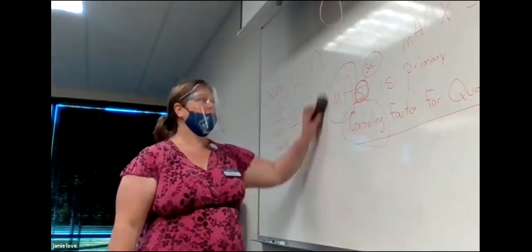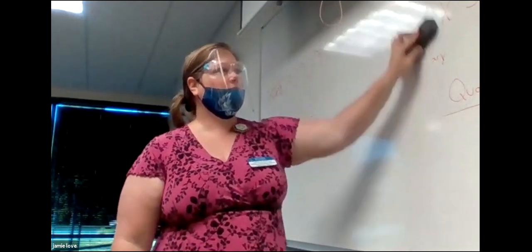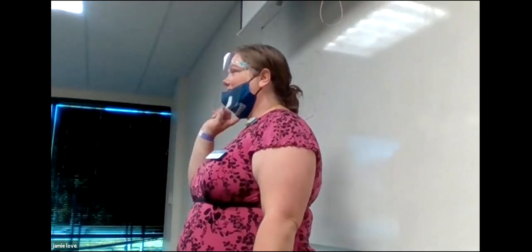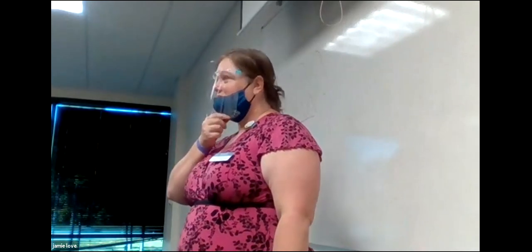So beam quality is always talking about the penetration. Quantity is number. Before I go into quality, what's some other things for quantity that we could have on a test question maybe? Quantity could be number of photons or number of electrons. How many? And then that magic word that everybody gets confused, intensity. That doesn't seem right, I know. The intensity of the beam is the number of photons in the beam.